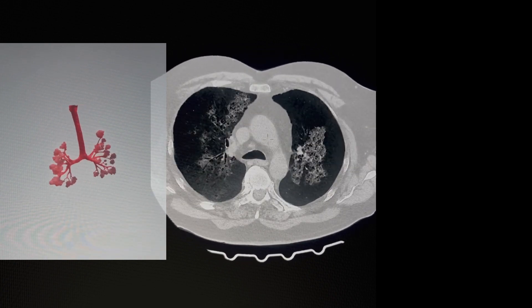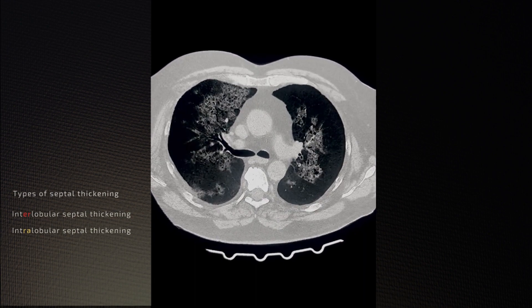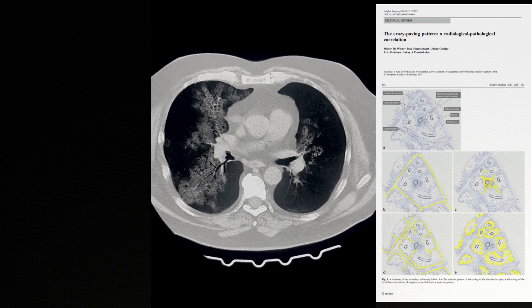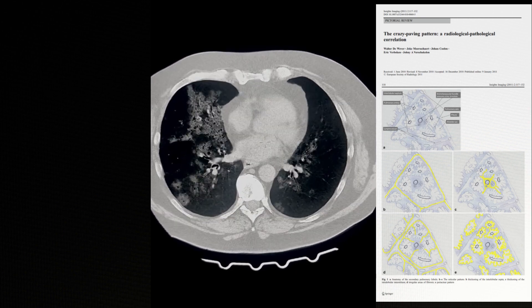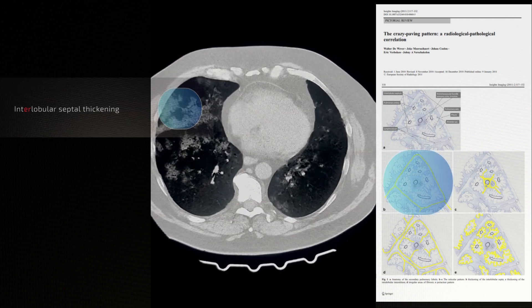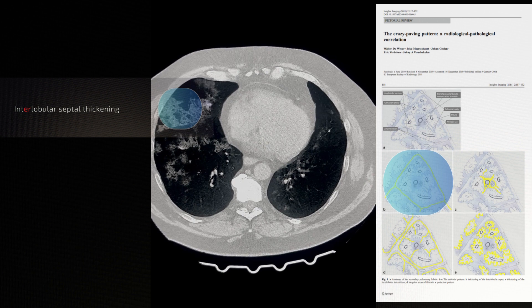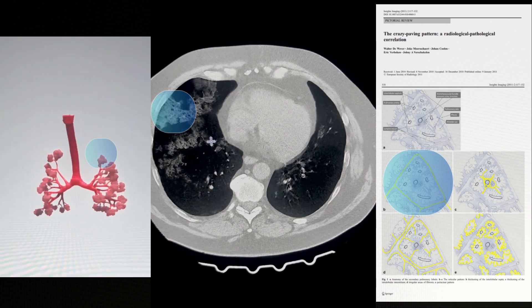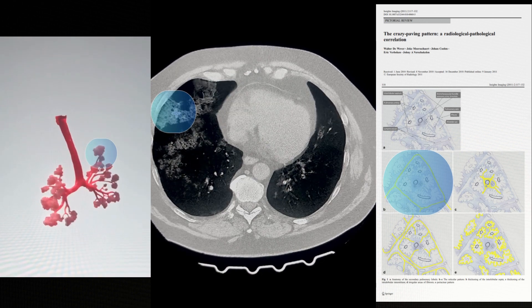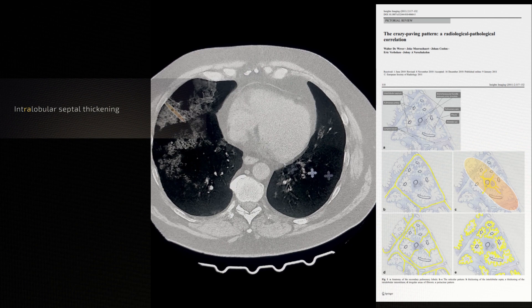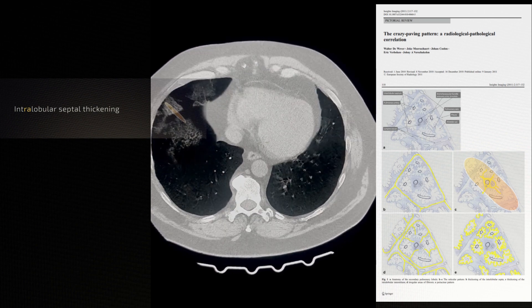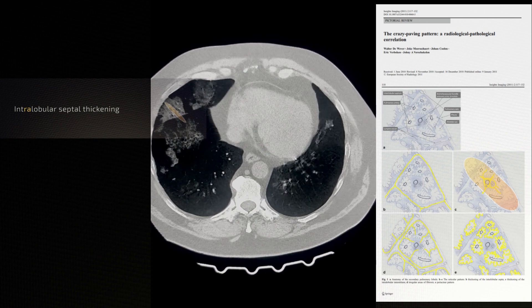For the crazy paving pattern, there are two forms of septal thickening. This includes interlobular septal thickening, which is the septal thickening surrounding the secondary pulmonary lobules, seen as these coarser lines. If you look carefully, there are further finer lines amongst these, which are the intralobular septal thickening.